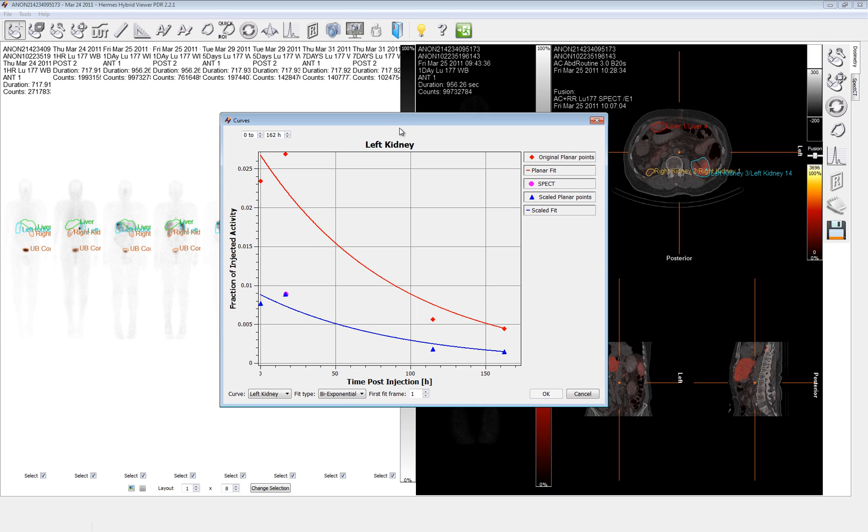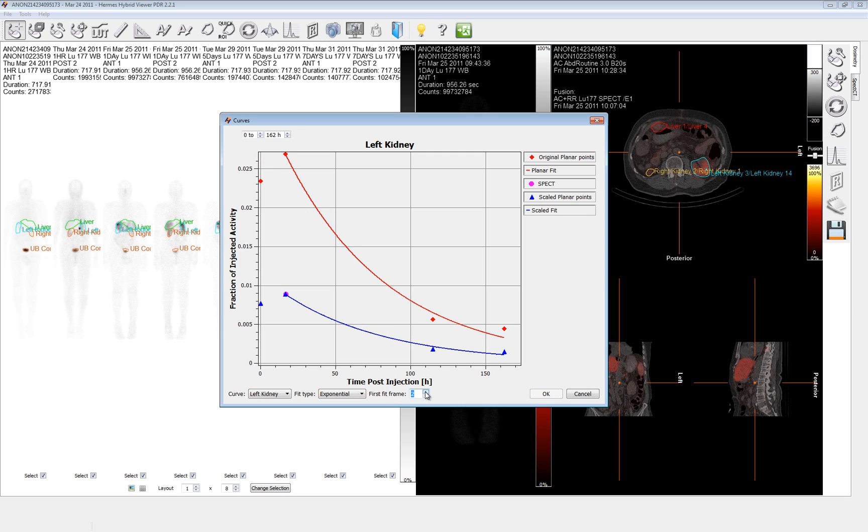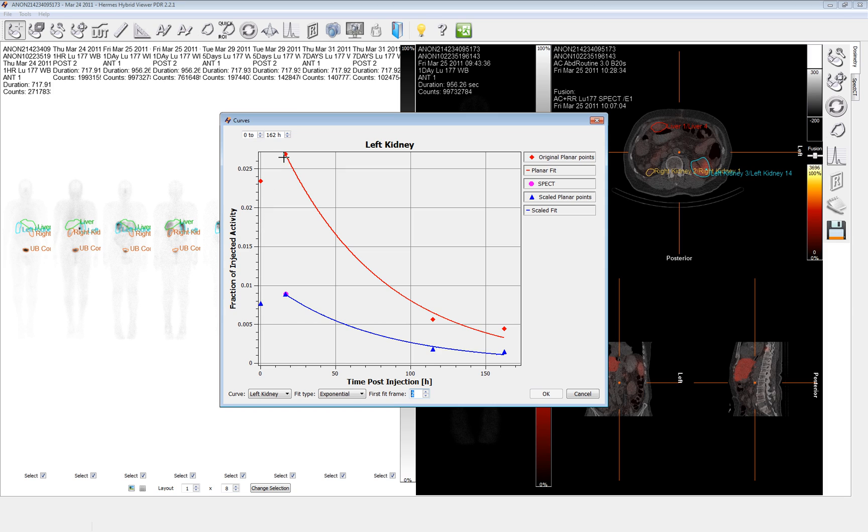And once we close that window, the window will automatically open for the curve fitting. As you can see in the left kidney, we've got a little bit of uptake still occurring after the first time point. So what I'm going to do is skip the first time point and go straight to the last three. Now, because I've now only got three time points that I'm fitting, my fit type went from a bi-exponential to an exponential. There's just not enough points to do a bi-exponential fit. It's also worth mentioning that we're numerically integrating from zero to the first time point to the first time point that we're doing the fit on.